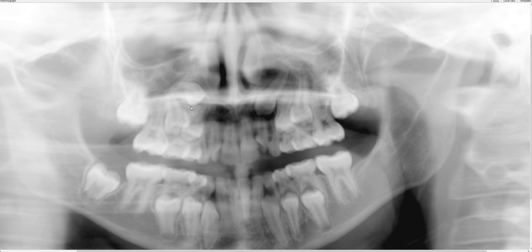The root of the premolar was mesially dilacerated, which makes me wonder — and I think what happened is — that as this canine tried to erupt, its eruption pathway was blocked by the roots of the first premolar. In the process, the canine may have caused the dilaceration of the premolar. This canine should have been located anterior to the premolar, just like the other side, but somehow it failed to position itself correctly, and in doing so it may have caused the dilaceration of the premolar.